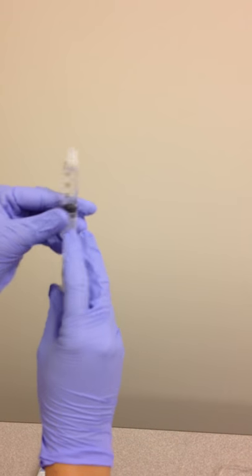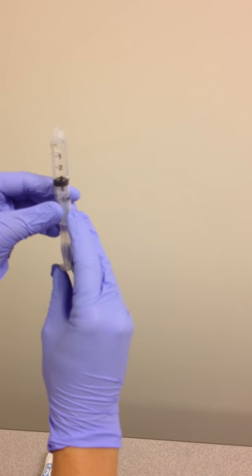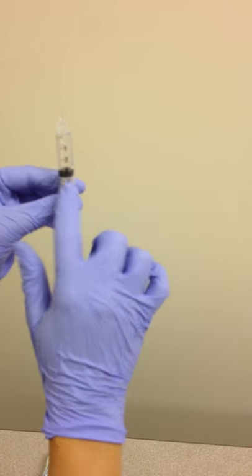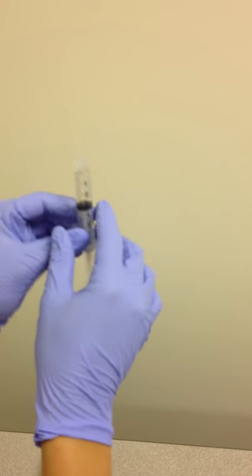For our burette, we will not need a needle, so we can discard that in the sharps container. Make sure all the air is out of our syringe, and as you see, we have three milliliters.